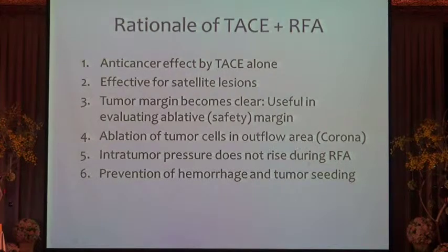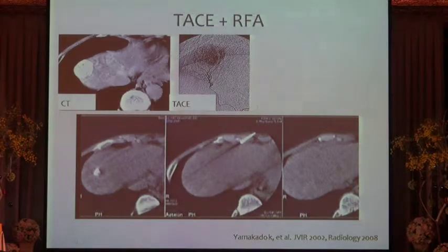I'll show you later. And intratumor pressure does not rise during RF ablation, leading to prevention of tumor seeding. Maybe, as Dr. Orim said, we can prevent transportal tumor spread, and it is useful in preventing hemorrhage. Let me show you one case.